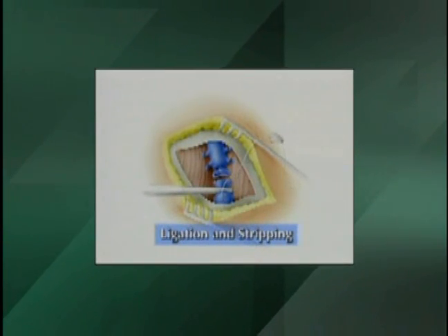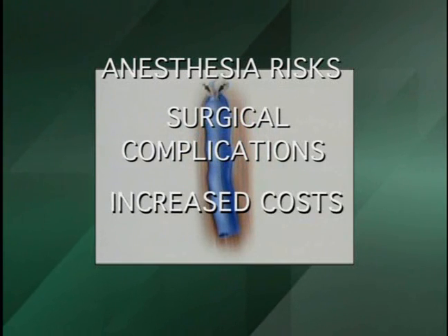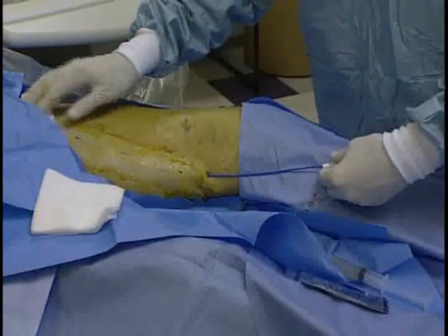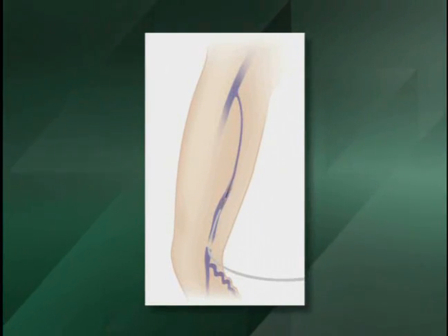The drawbacks of surgery include risks associated with general anesthesia, surgical complications, increased in-hospital costs, and prolonged recovery. Also, recurrence is common following ligation and stripping of the GSV. Recently, there has been interest in less invasive alternatives. Endovenous laser treatment, EVLT, allows delivery of laser energy directly into the blood vessel lumen in order to produce endothelial and vein wall damage with subsequent fibrosis.